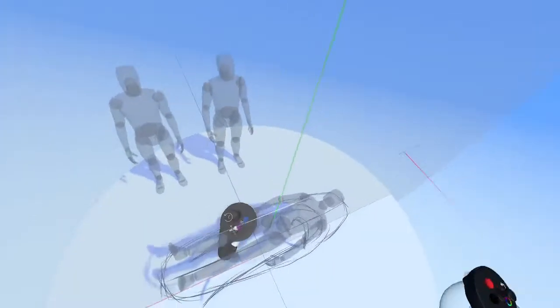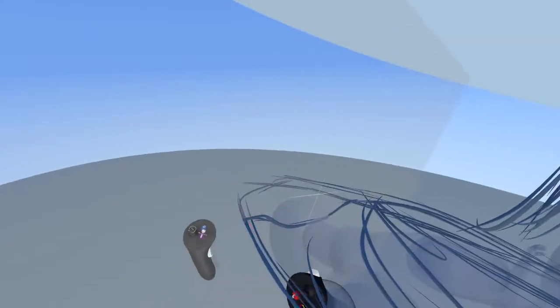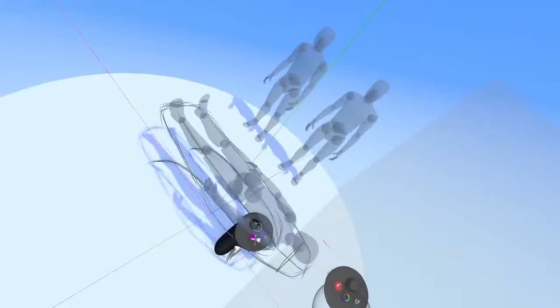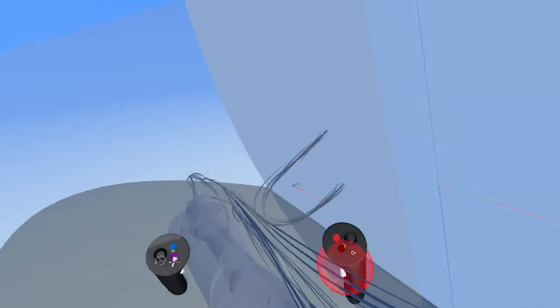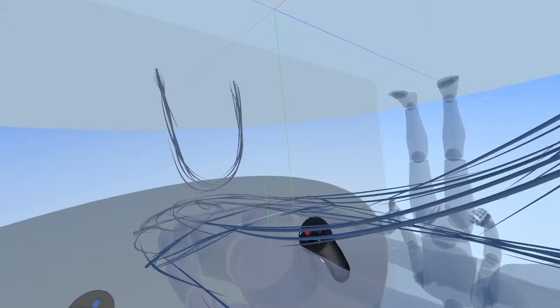All right. And by the way, if you have the planer tool on, you can also snap it this way and have something similar to a section line. So if you're an automotive designer, section lines are really important for identifying what your surfaces are doing, and then they can also help somebody understand the proportion of your vehicle. So in this product design sense, it's just going to tell us exactly what the shape of this table is doing.